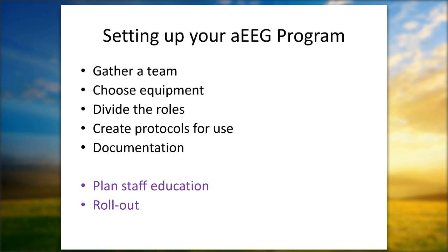So the next section is really, in order to get people comfortable with looking at the devices and to be willing to document in the medical record, it's important to do a lot of staff education. And again, this is maybe divided into several groups of people, whether you have your group who are going to be your equipment super users, applying the device and applying the electrodes. That might be one group. And then you have the bedside nurses who will be caring for the patients and maybe teaching them in a little more detail about the tracings, about how to document, marking events and other important things on the device, the day-to-day, moment-to-moment use of the device.